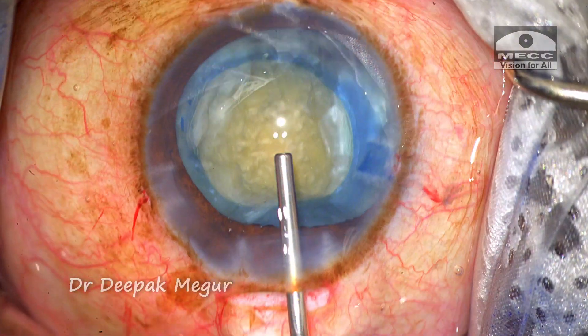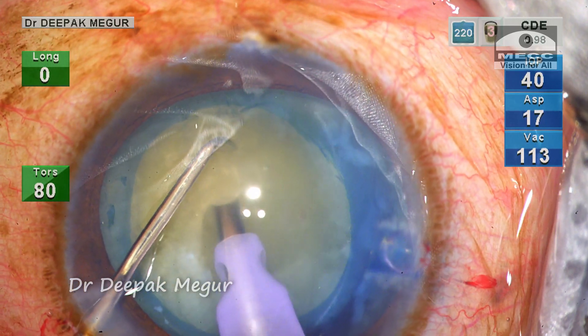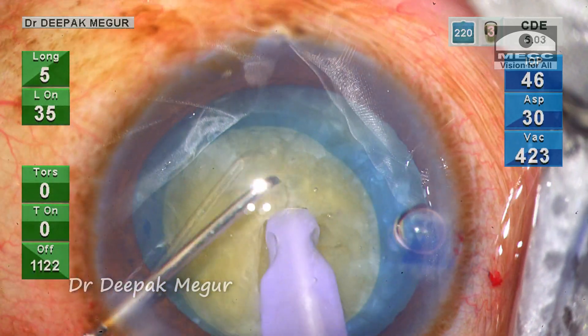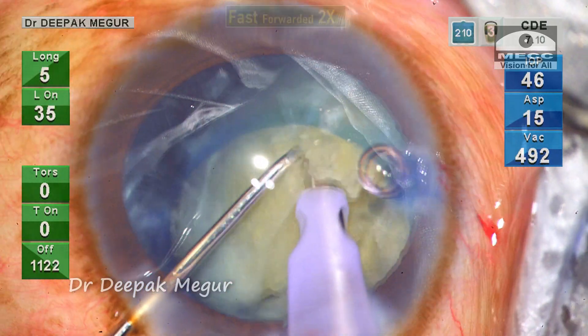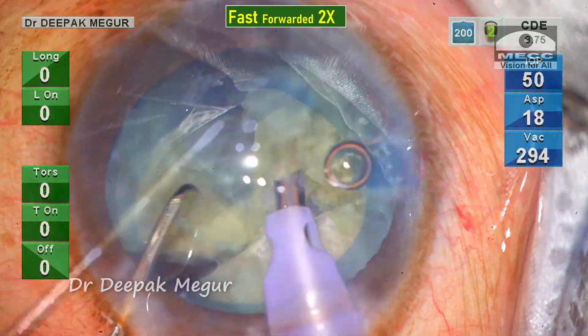Time to phaco. I create a very small trench by sculpting the central part of the nucleus so that I get a firm grip before initiating the first vertical chop. The nucleus is subsequently divided into multiple smaller fragments. This is easy because the nucleus is not very dense.